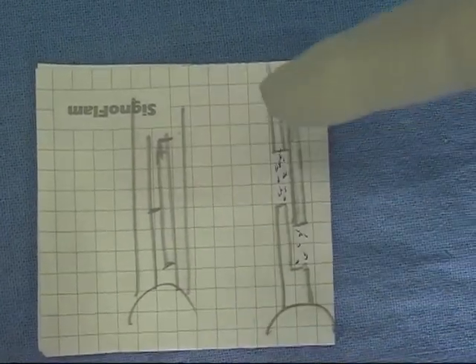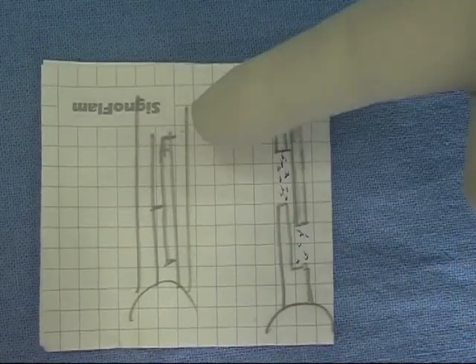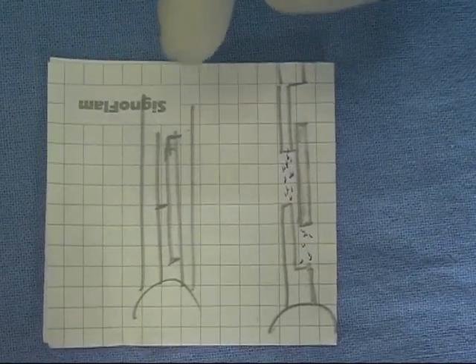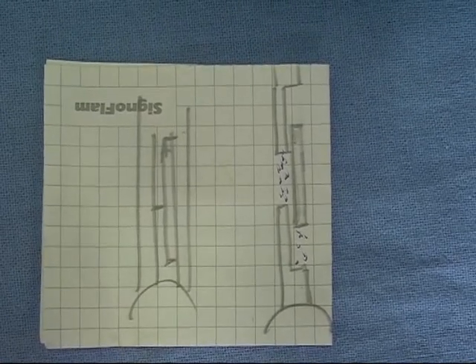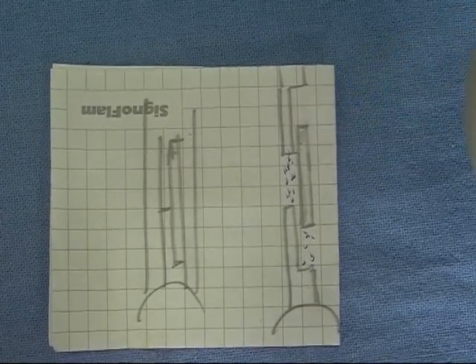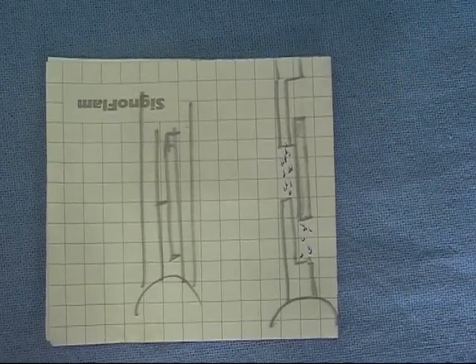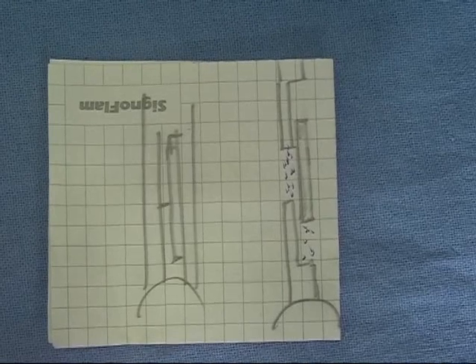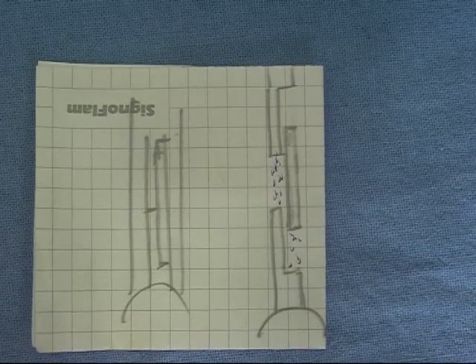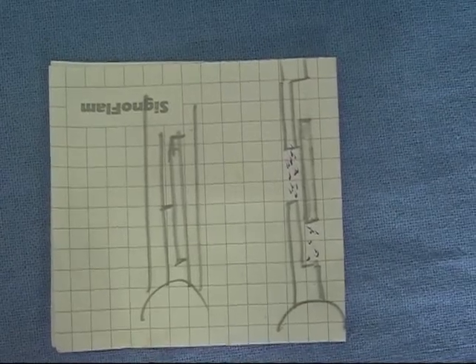Marked on the patient — this is the heel, and I have marked a linear incision with two cuts on the lateral aspect and one cut on the medial aspect. When we do a forceful dorsiflexion, these two parts of the Achilles tendon will separate out and move away. In the defect there is formation of new collagen tissue. We need to support the foot in plaster of Paris or any splint for at least one and a half months, so that the new collagen forms and the Achilles tendon heals in a lengthened position.